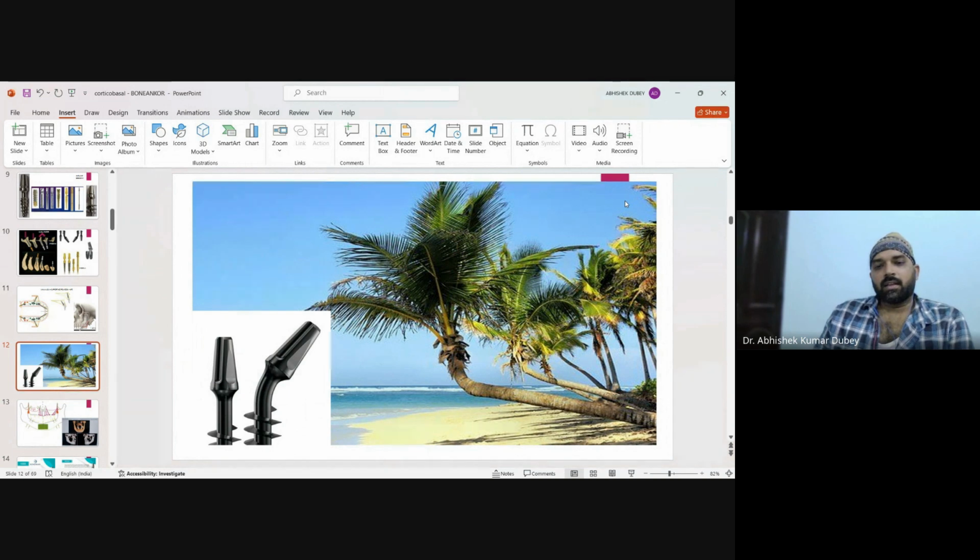Okay, and you see this coconut tree. The roots of this coconut tree are so far away from the load bearing or load area. Okay. Similarly, and still the coconut tree is alive and it's functioning. Every year the fruits happen. Okay, people like me will go and sit there. Okay. But again, see, the implant has been bent, occlusal loads have been applied.